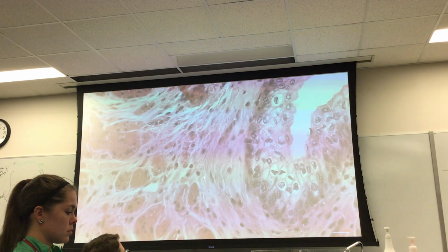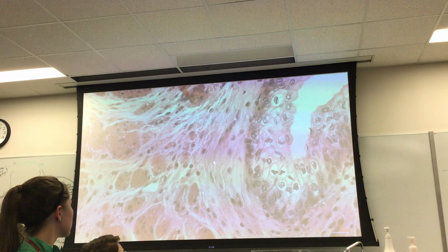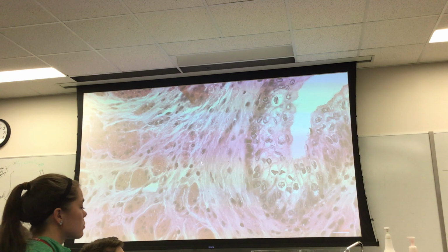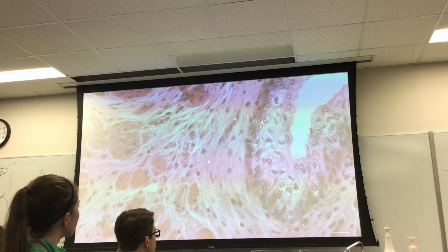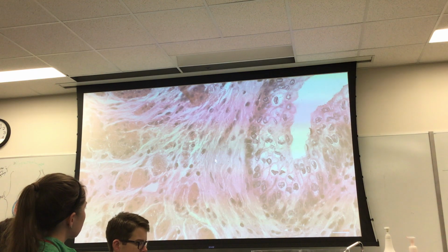I'm trying to do histolookalikes. Now while I'm here, this, where the arrow is right here versus the arrow right here, let me ask you a question. Is that the same tissue type? Here versus here. That is not the same tissue type. What do you suppose this tissue type is? What do you think? Again, is it muscle? Nerve? No. It's not an epithelium because it's not bordering a lumen.